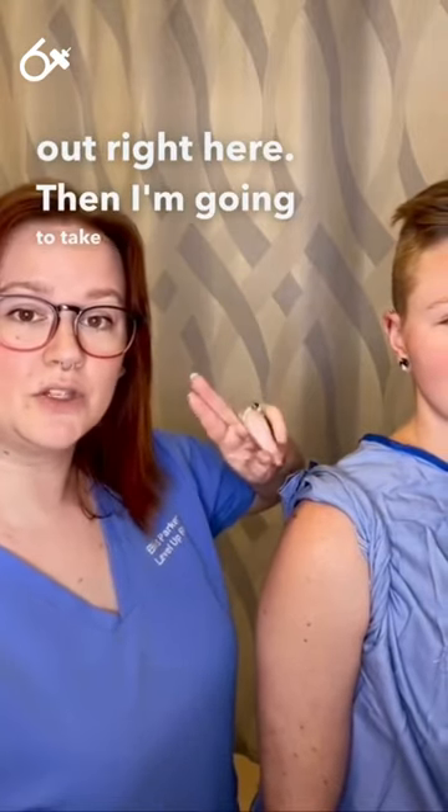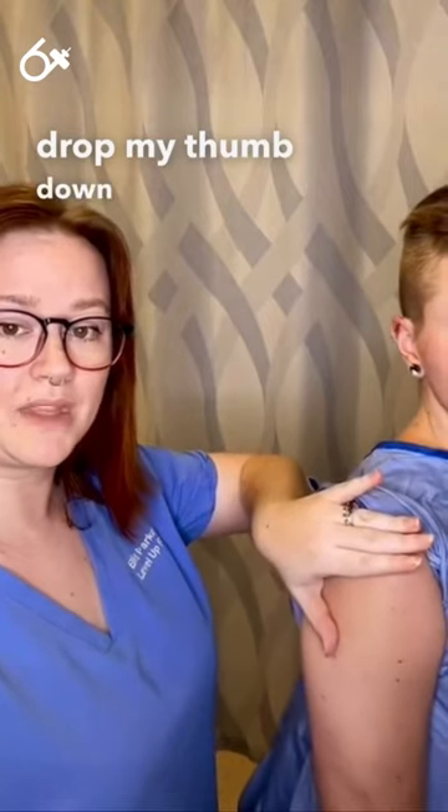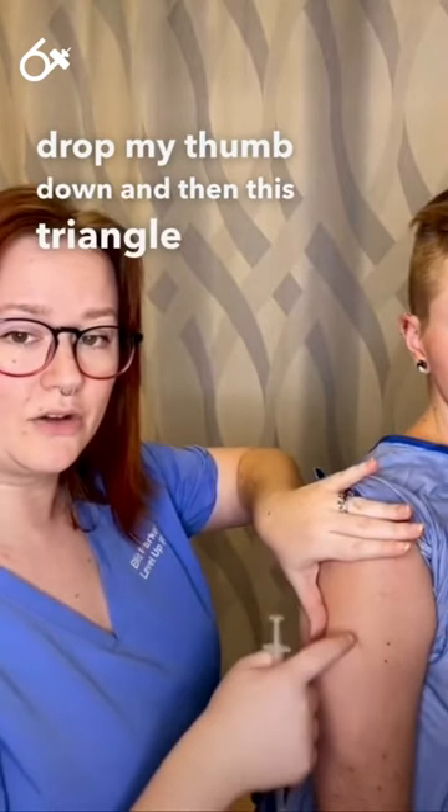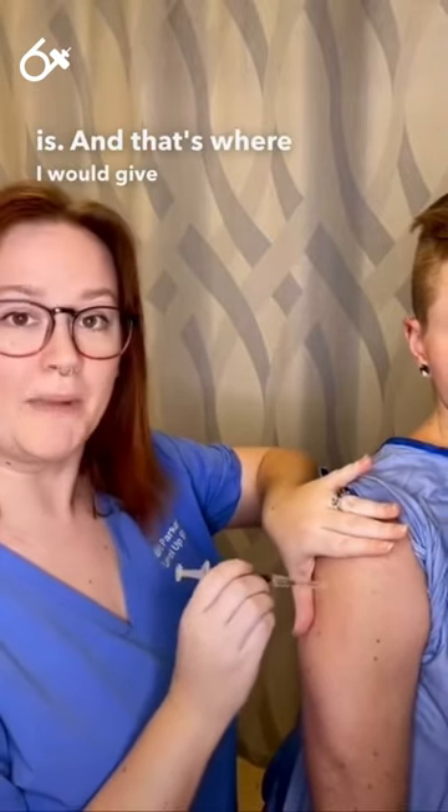Then I'm going to take two or three fingers and place them right at the acromion process, and drop my thumb down. This triangle is our safety triangle — that's where the deltoid muscle is, and that's where I would give my injection.